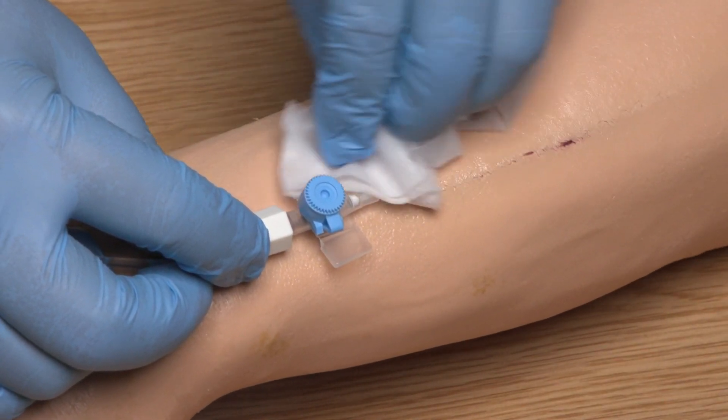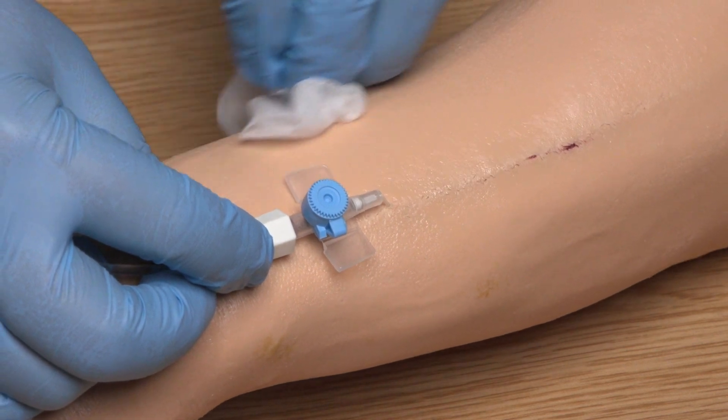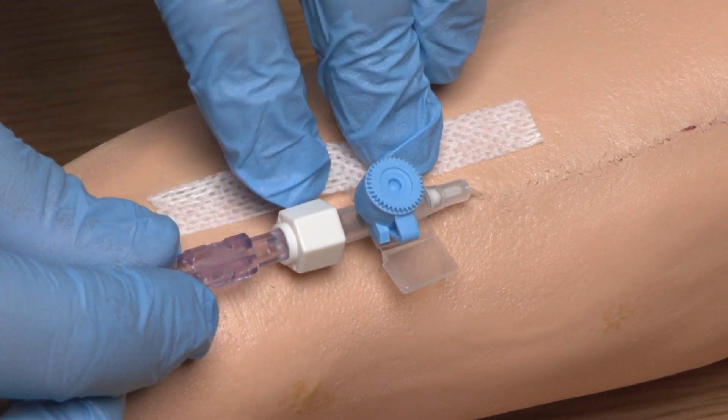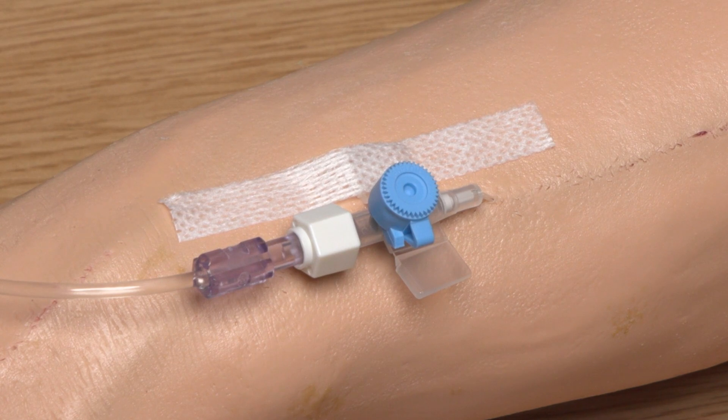I'm doing this for 30 seconds and then I need to allow the solution to dry naturally, which also takes about 30 seconds. I can now apply the new PVC dressing. It is important when applying the dressing that you don't touch the sections that are going to come into direct contact with the skin, as this increases the risk of device related infection.